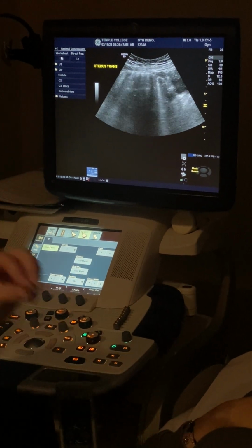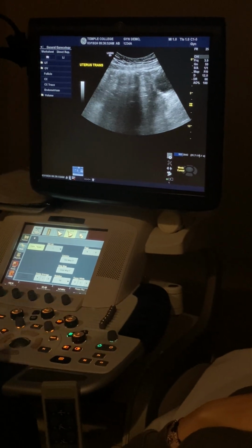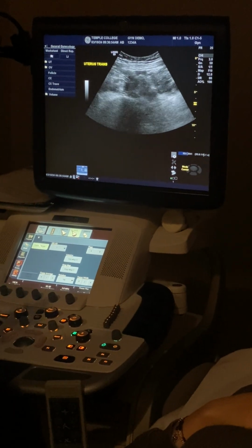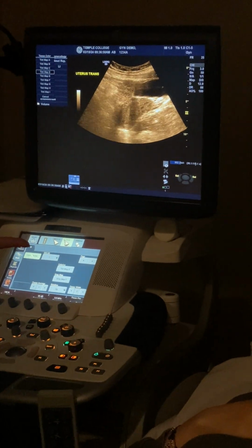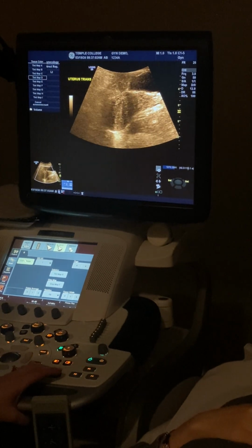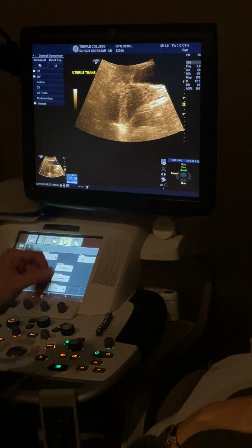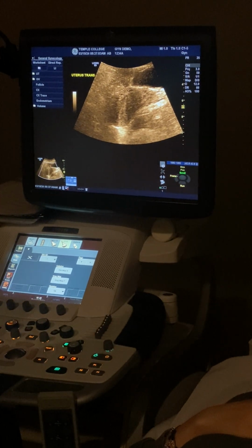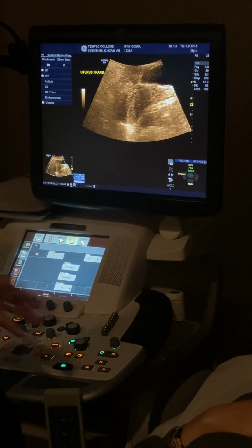But it should stand out to you as clear in trans as it does in long. And so you can mark those borders. Just make sure you can see those borders clearly. A lot of times we've seen me change it to a tint map. Anybody who's watched me scan in clinicals, that tint map will change what your eyes are seeing. Just for the moment, for something that's subtle, that's got diffuse margins, something that doesn't stand out super crisp and clear to you, and you've changed your frequencies and you've changed your gain and all that.